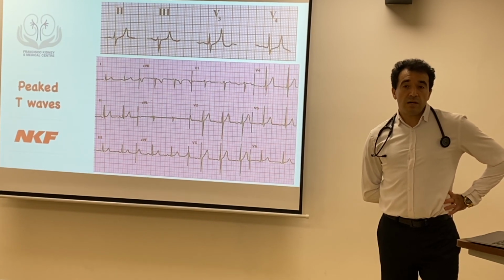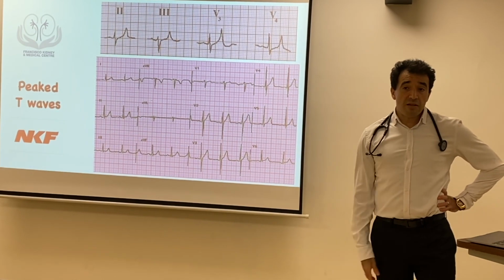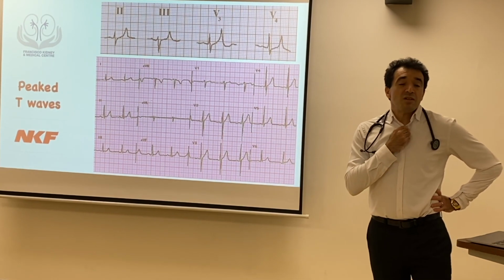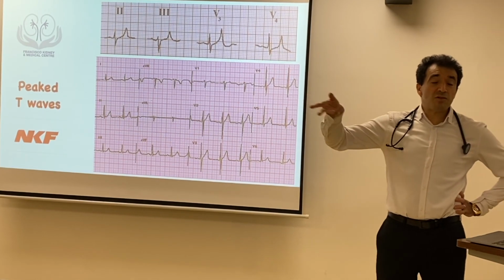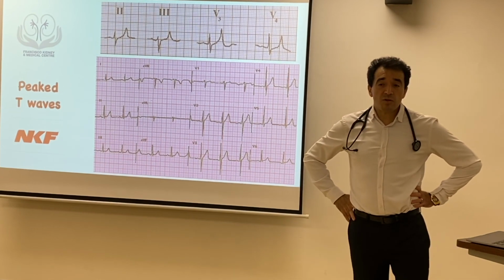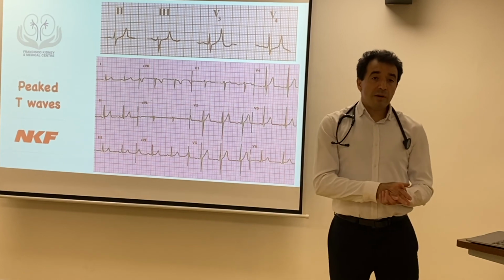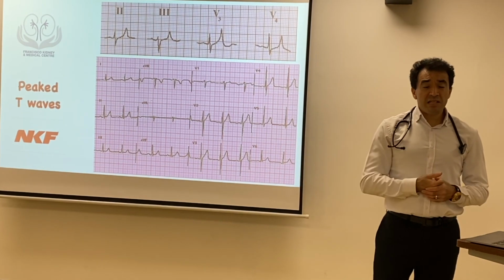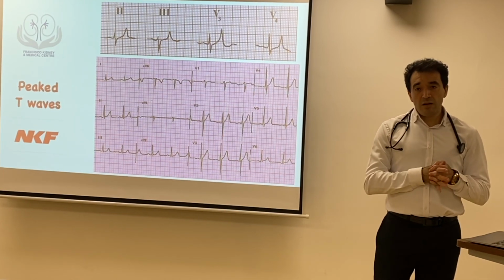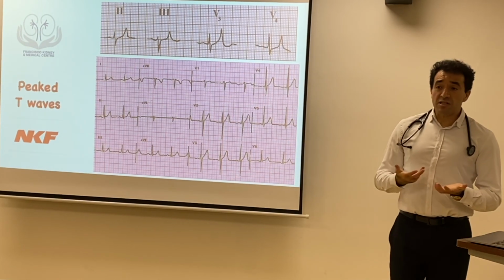Either if they have one of these blocks, typically a pacemaker; if they have arrhythmias, they will require that. But sometimes, depending on the arrhythmia, if it is a re-entrant supraventricular tachycardia, sometimes just an ablation can be done. The problem also depends on what the arrhythmia is, and sometimes it has to do with proper analysis, because some patients might have different pathologies going on. So at the end, electrophysiology studies are important.